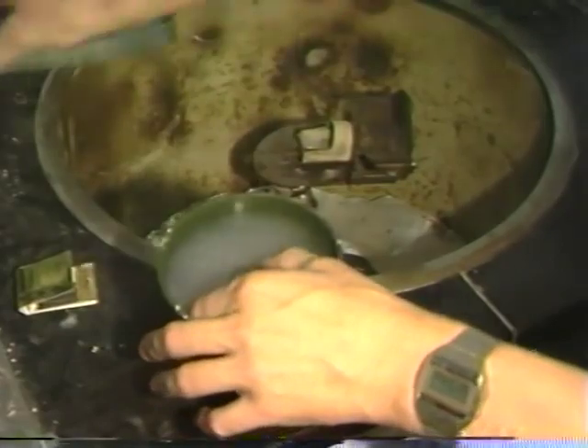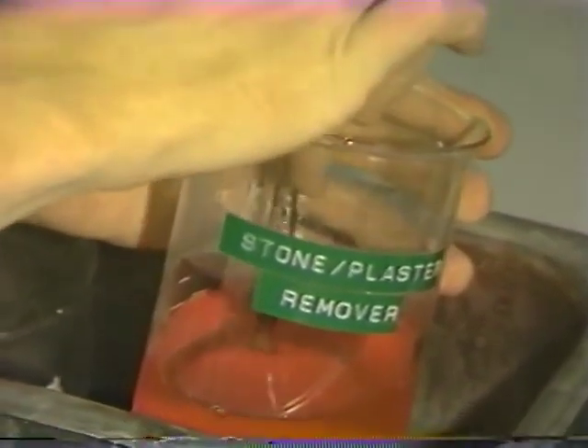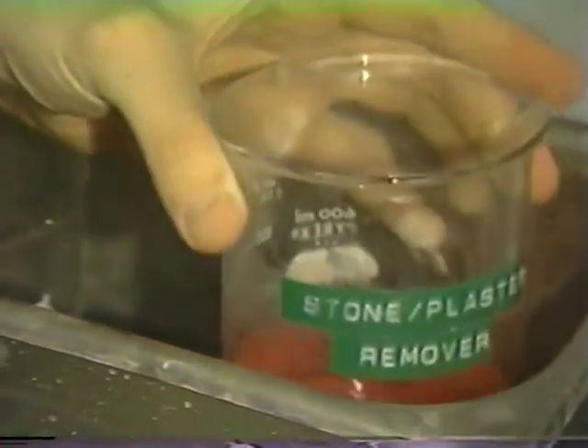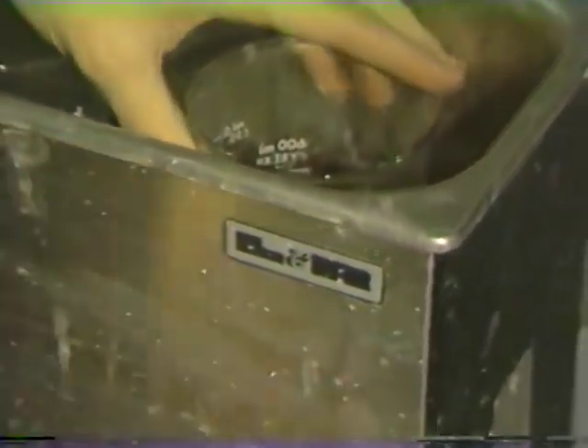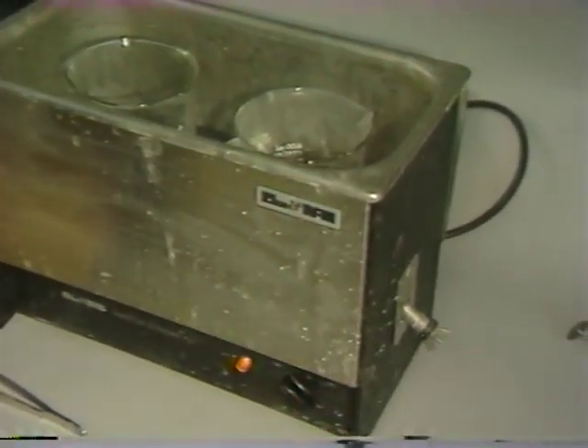The casting can now readily be retrieved by pushing the entire assembly out of the ring. The casting is carefully placed on the bottom of a container with general purpose or preferably stone and plaster remover, which is positioned in one of the ultrasonic units and turned on for a cycle to make sure that all investment is indeed removed.